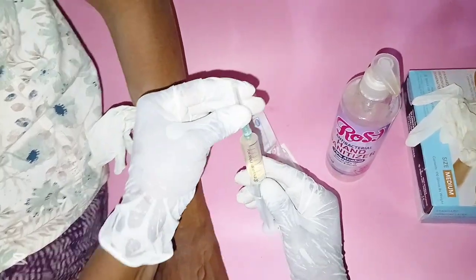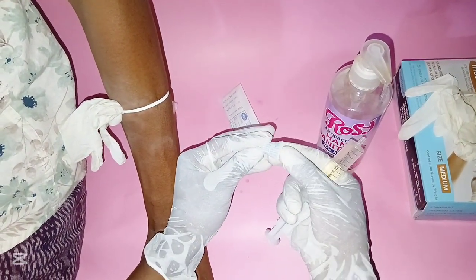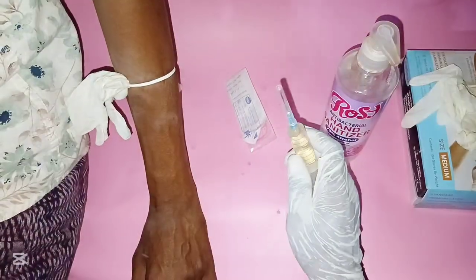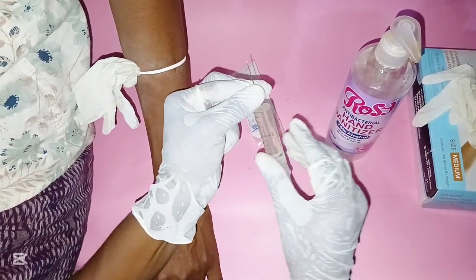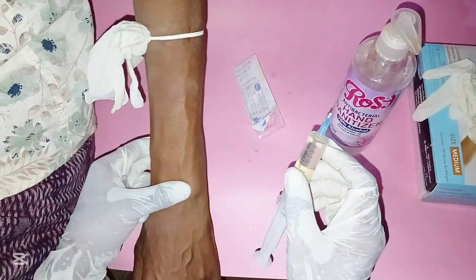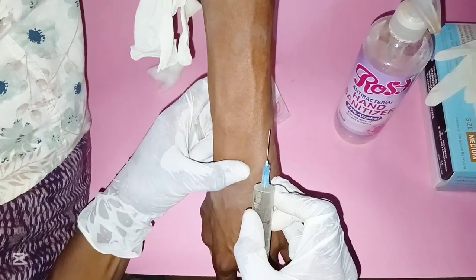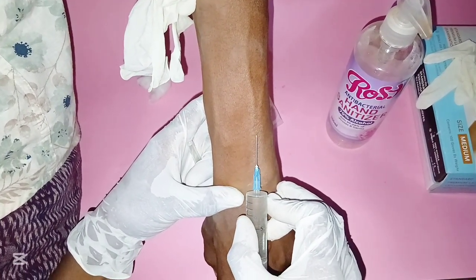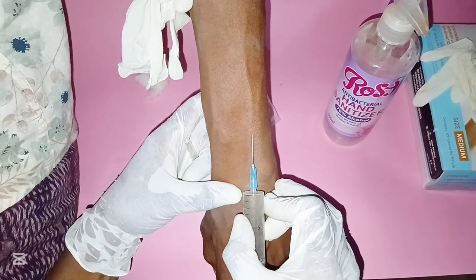Replace the 21 gauge needle with a fresh 23 gauge needle. Attach the syringe to the 23 gauge needle securely and remove the cap. Retract the skin for flexibility to keep the vein intact, then insert the needle at a 15 to 45 degree angle into the vein.